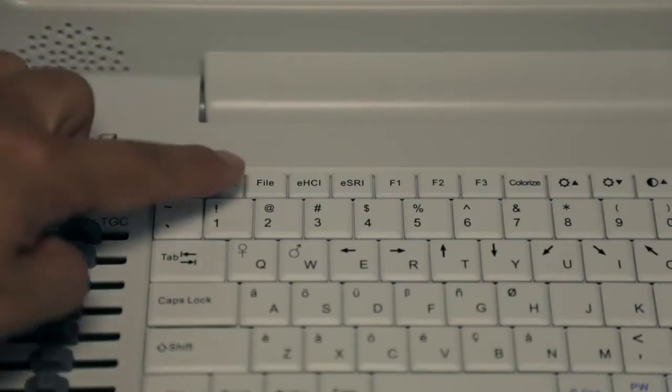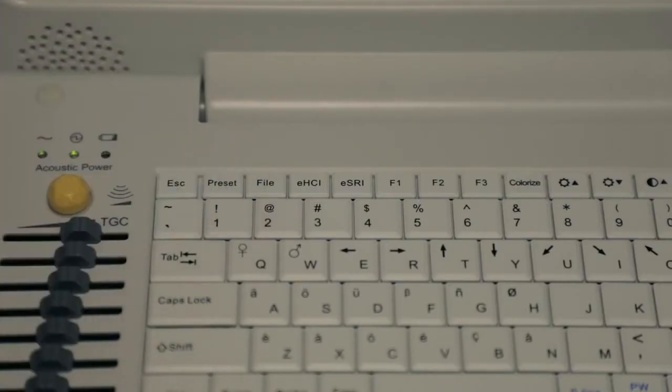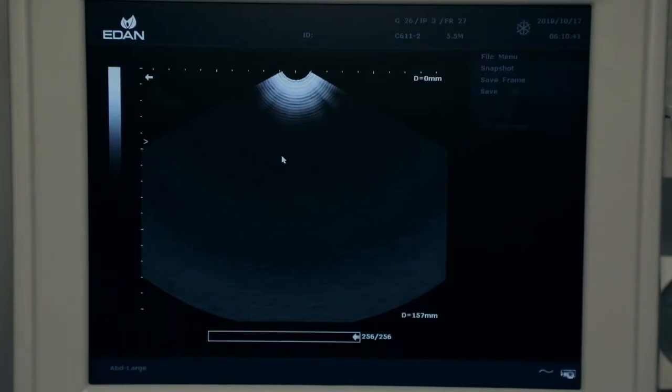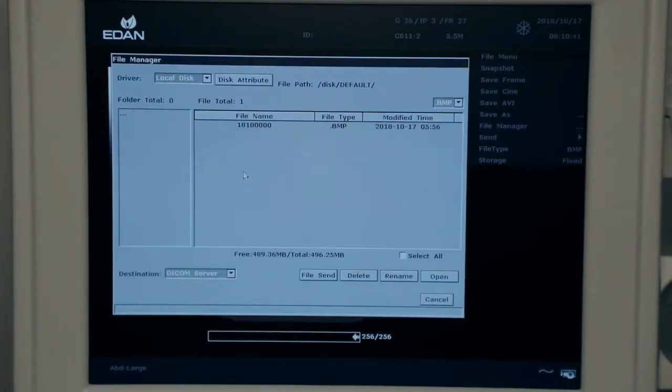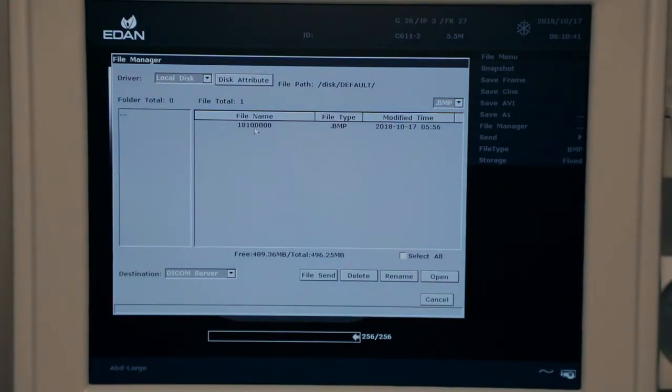To review an image, press file key, highlight file manager using trackball and press set. Double click on desired exam to review.